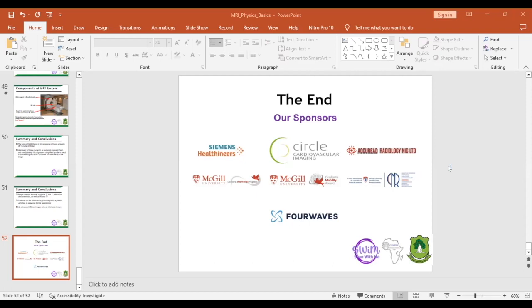For the TI Scout, I understand that before you run your short axis post contrast, you should be able to select an appropriate TI Scout for your scan. There are one or two things that affect this and give you a wrong answer, because you are trying to locate the myocardium that is darkest. If you are not very observant and you select a wrong myocardium, you might not be able to get a good post-contrast short axis scan.